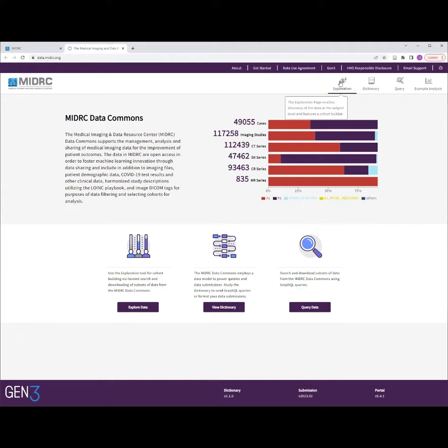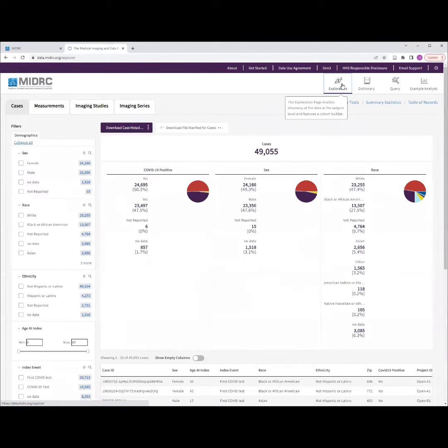To begin, we utilize the Exploration tool, which you can access via the Exploration tab on this webpage.